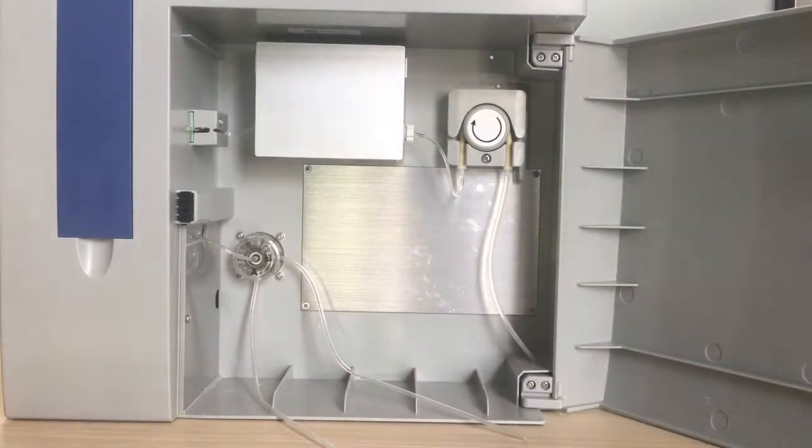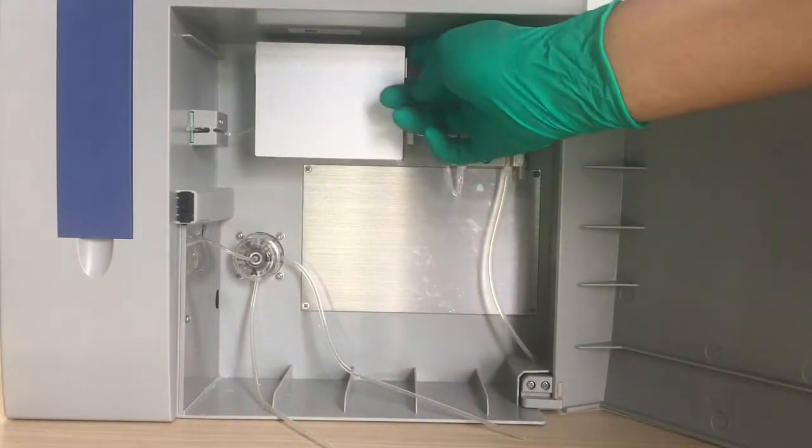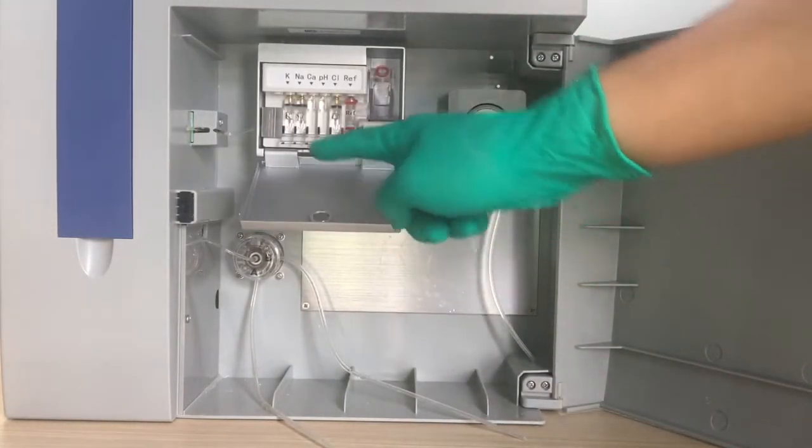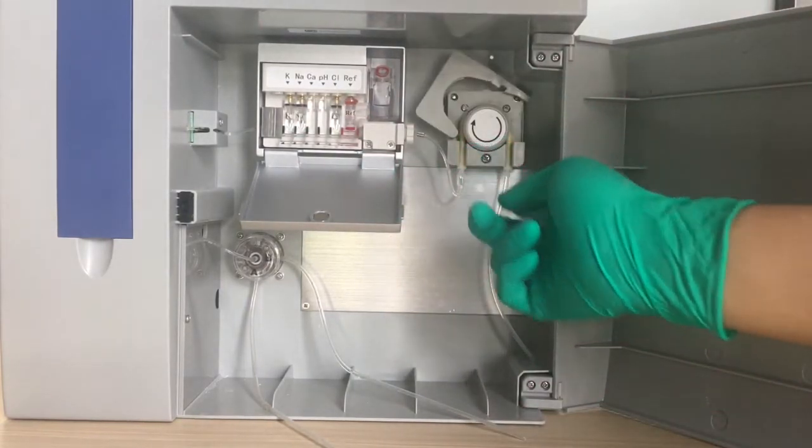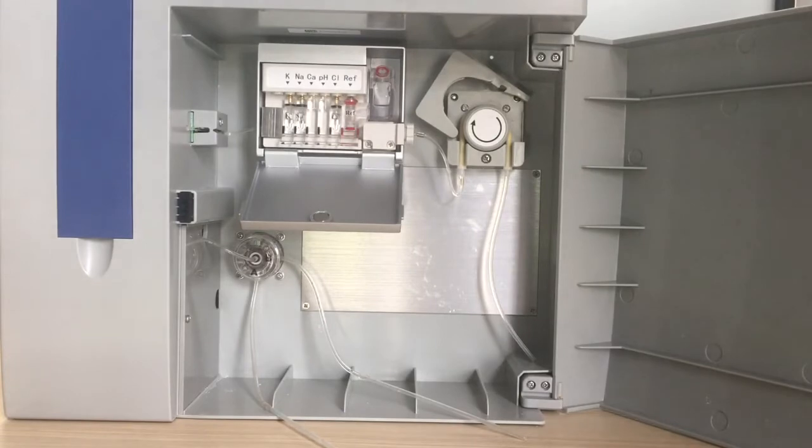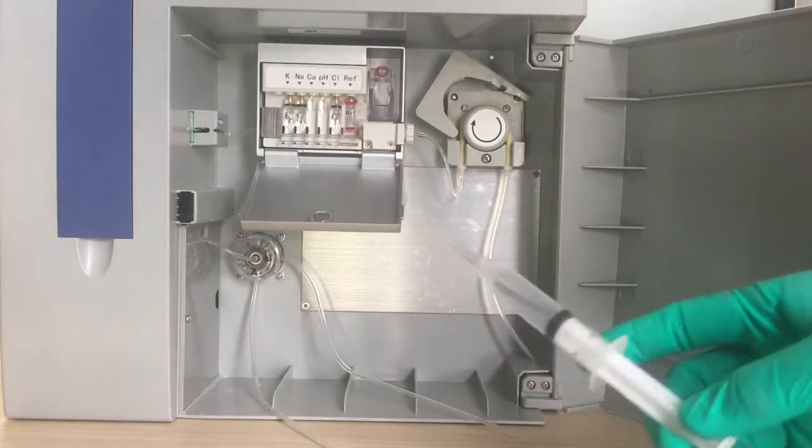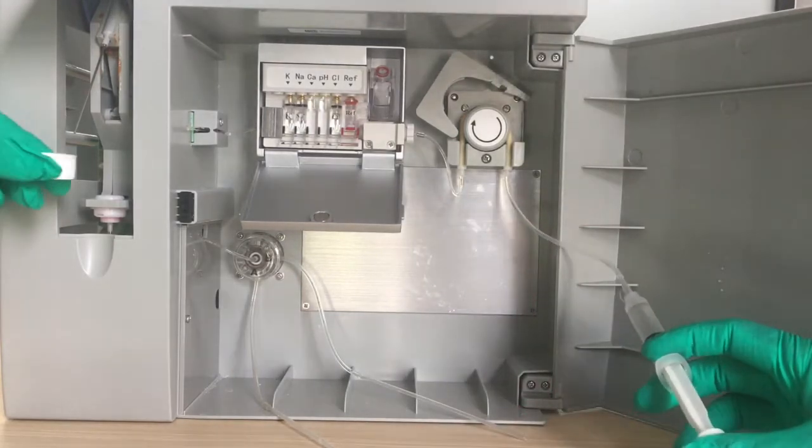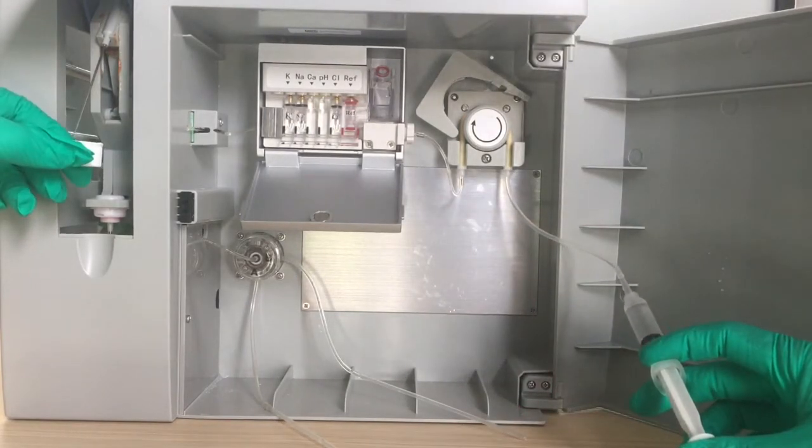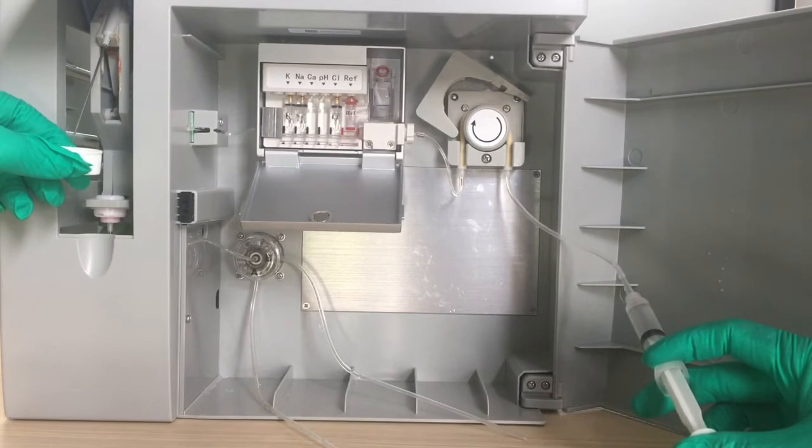To remove the blockage part-by-part, first we make sure the electrodes are installed, then we unlock the pump tube. Then use the syringe to take some distilled water, connect with the tube, and open the flap. We inject the water.